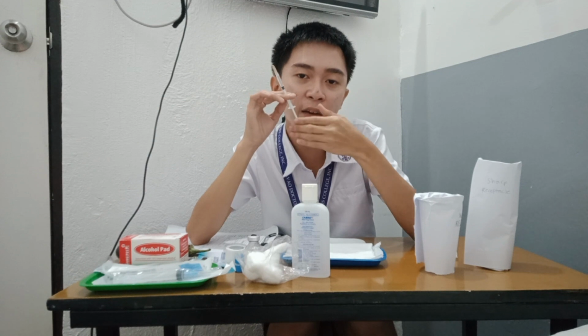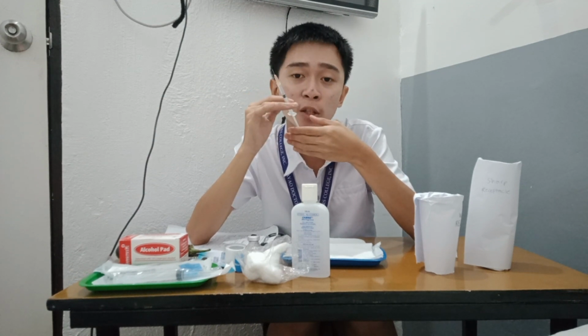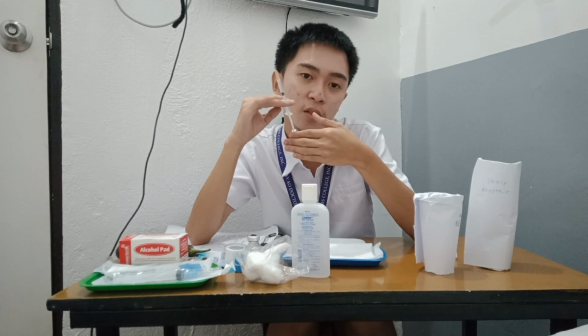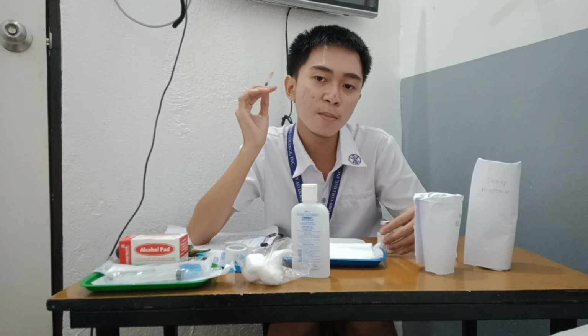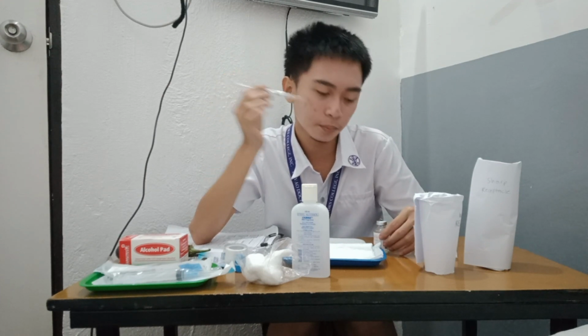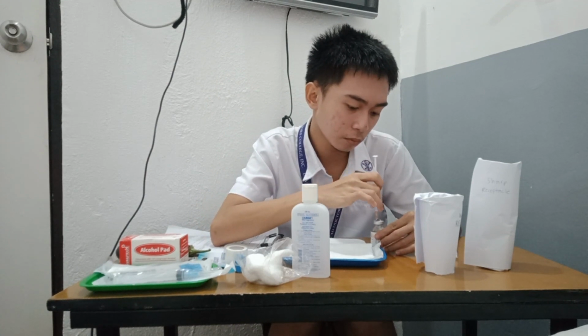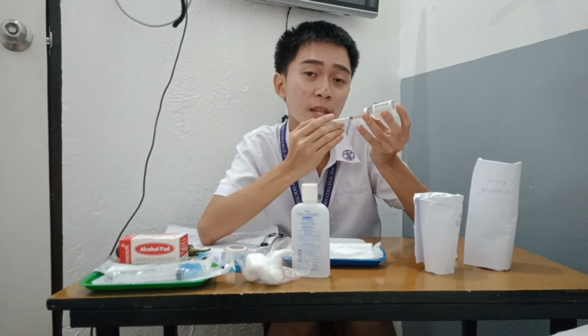Inject the air into the vial, keeping the tip of the needle above the surface of the medication, and withdraw the amount of medication using either of the following methods. Hold the vial down with the base lower than the top and move the needle tip so that it is below the fluid level and withdraw the medication. So invert the vial, ensure that the needle tip is below the fluid level and gradually withdraw the medication.